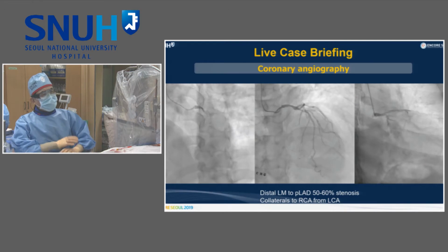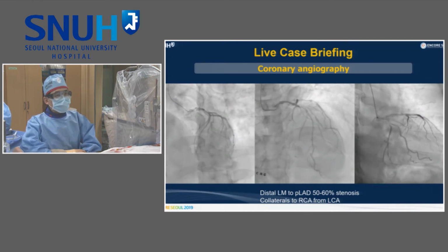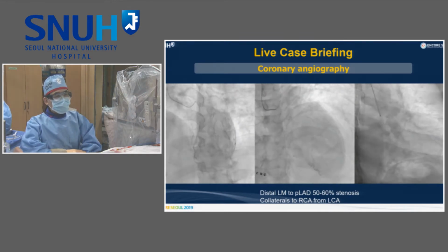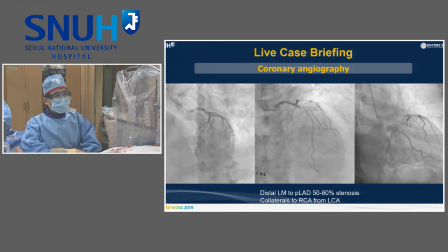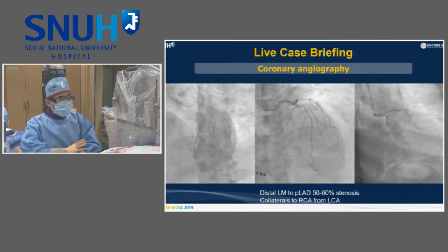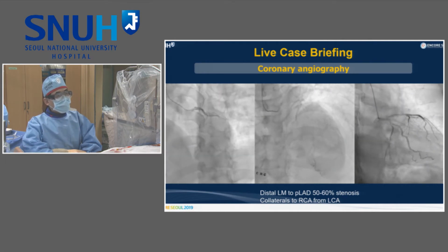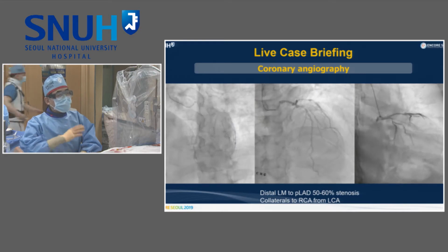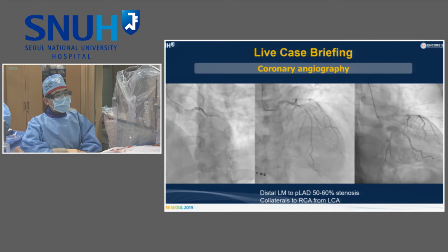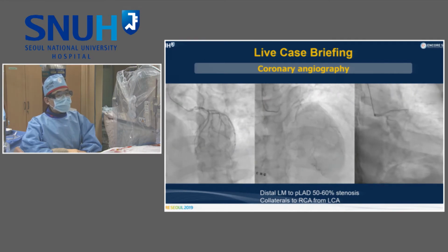Of course, the myocardium will accommodate to such kinds of CTO lesions, but actually when we open those lesions, there's a whole change of life. Thus, I always try the CTO intervention first, then see the patient's improvement, then we can decide on other minor lesion treatment. But in such a dominant case, definitely CTO is required. Any other comment?